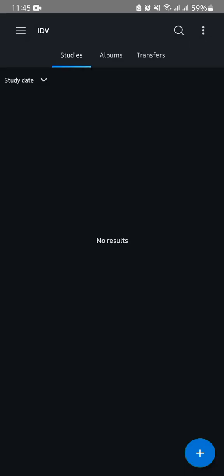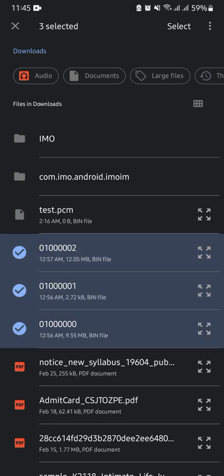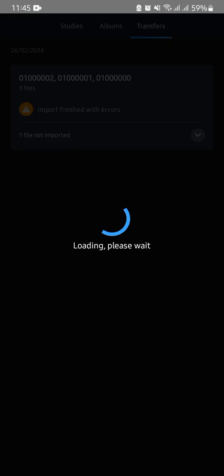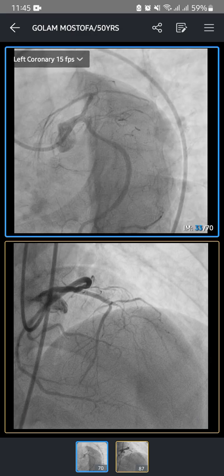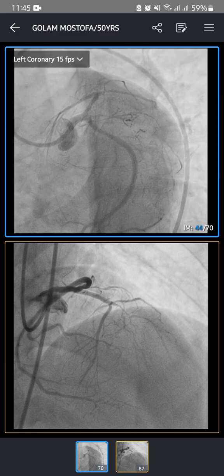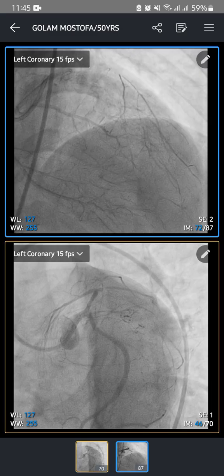My DICOM file exists in the download folder and I have three DICOM files for demo — it's not only three files, there are many DICOM files, I just chose these three. Select them and it is importing now. Once ready, you have to move or drag and drop your finger on the display and you can see the animation images one by one like this.